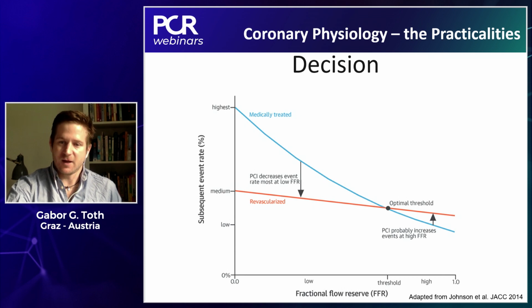On the other hand, I believe that in clinical practice, we have to also understand that, as shown by Niels in this paper a couple of years ago, there is a risk continuum over the spectrum of FFR and the outcome of cases with or without revascularization. We know very well from data now how lesions behave without revascularization over the spectrum of FFR. However, what we do not really have for practice is understanding the risk spectrum of different revascularization methods in different complexity of interventions.